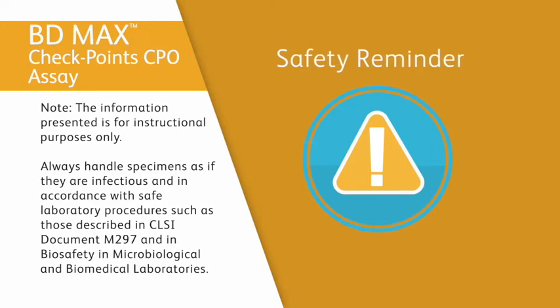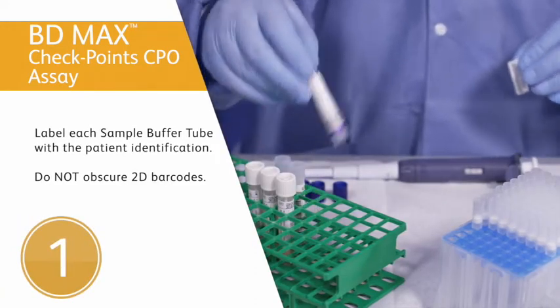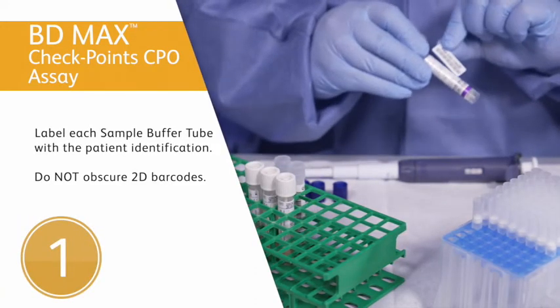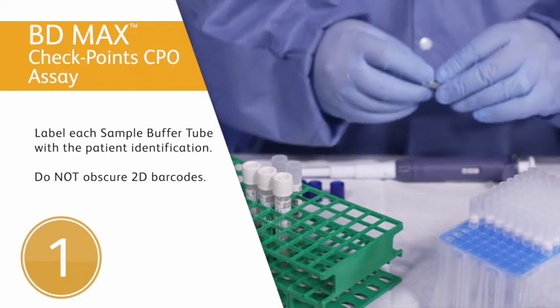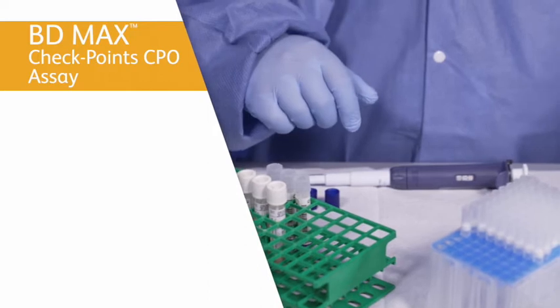Here's how to prepare the specimen. First, label each assay-specific sample buffer tube with the appropriate patient ID. Be careful not to obscure, write, or label over the 2D barcode.